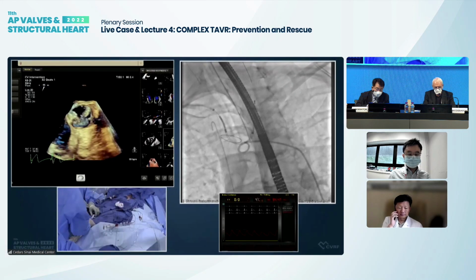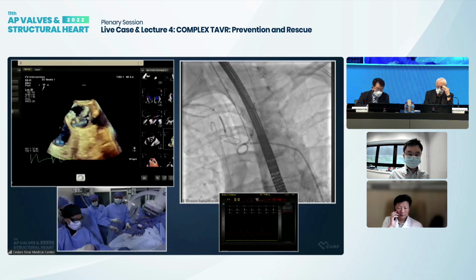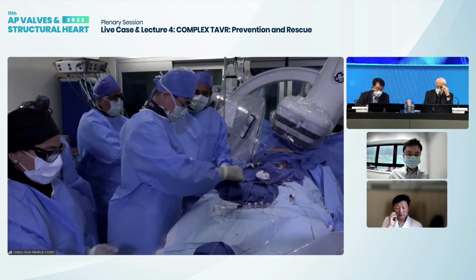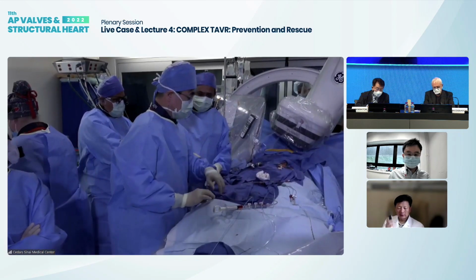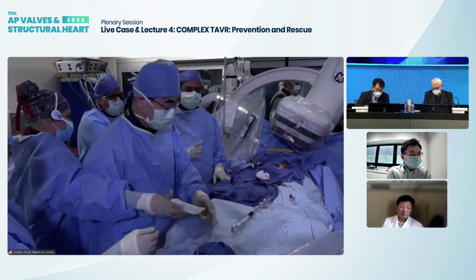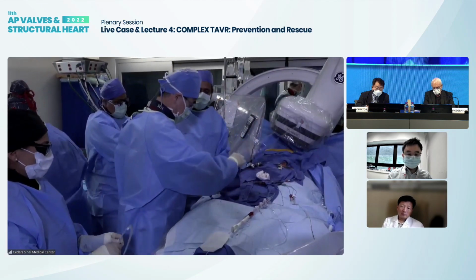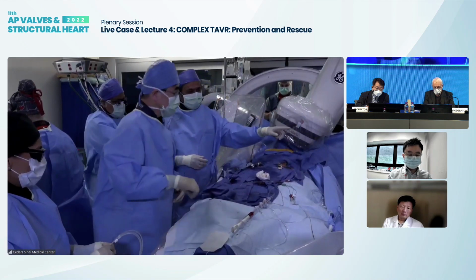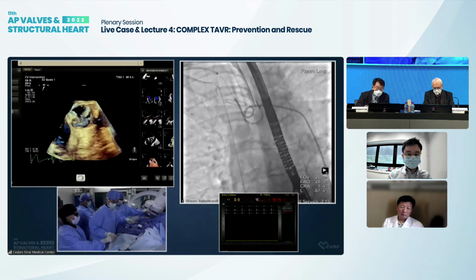And I think that when you have very, very heavily calcified valves, is there an advantage to using a self-expanding valve? Perhaps, but I think often you end up post-dilating anyways, right, in some of these patients. So I would say that the primary reason for us is our experience with this valve. So you saw in the last 2 minutes, we advanced the Sentinel device. Yes. And we deployed the 2 filters. It was all done real time, live.